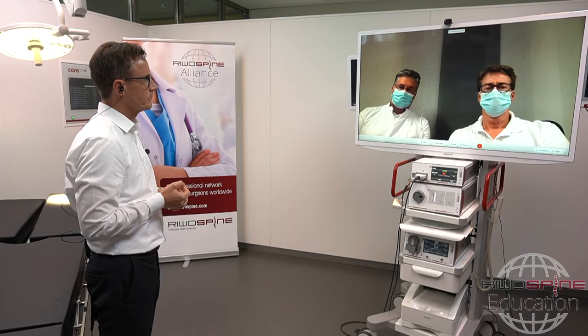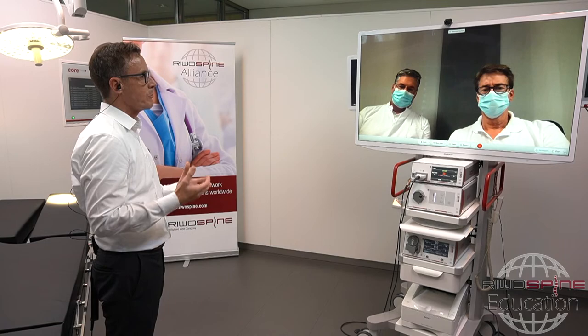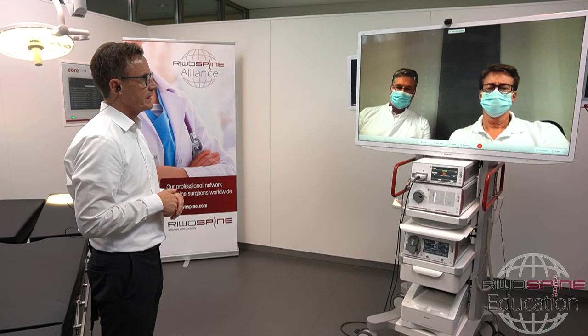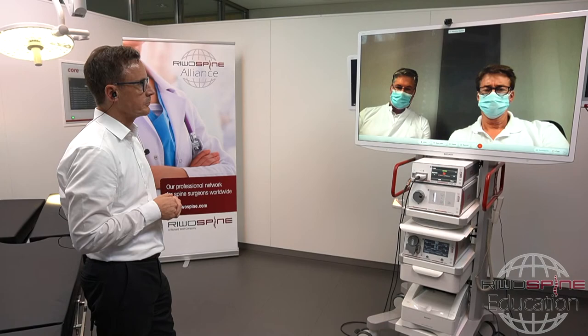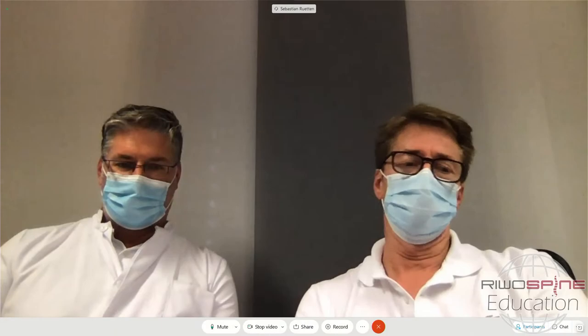Dr. Rutten, one more question about the instrumentation for these cervical endoscopic procedures. Are you using the same sizes of rongeurs and forceps as you use for the lumbar applications, or do you use smaller diameters for the cervical spine? Yeah, we prefer to use a smaller endoscope at the cervical spine and also smaller instruments. That means usually 2 millimeter, 2.5 millimeter, or 3 millimeter, up to three. But sometimes you really need very small instruments to work inside the spinal canal without damaging the dura.